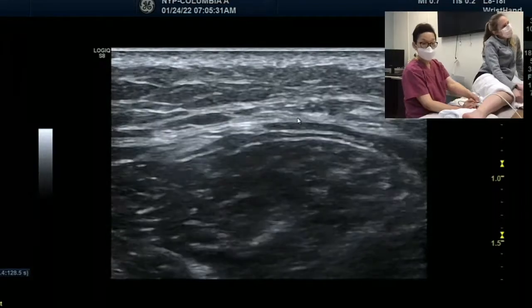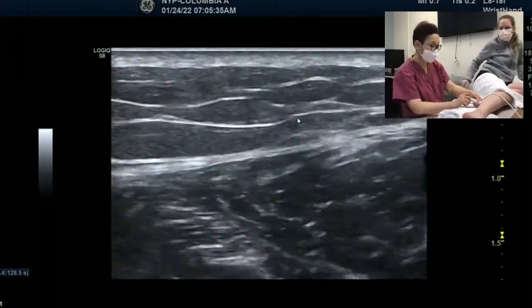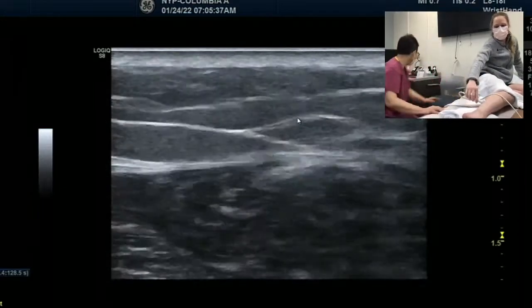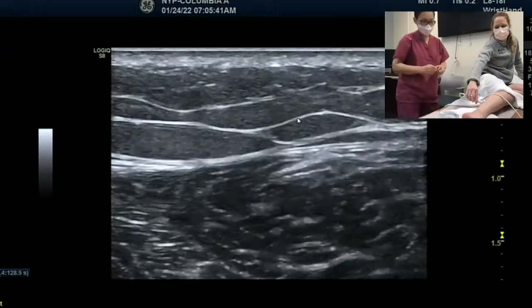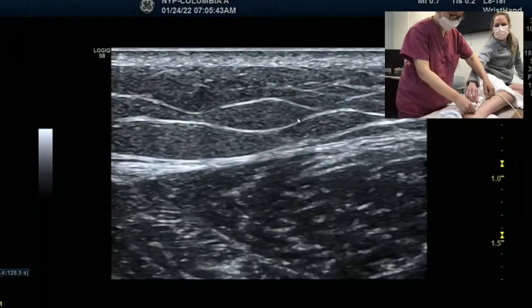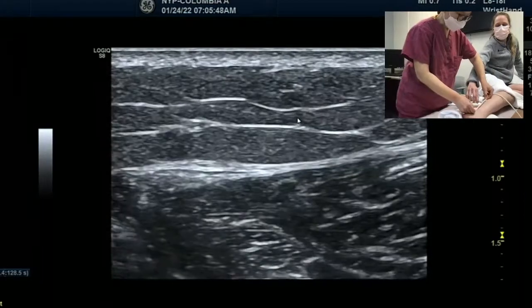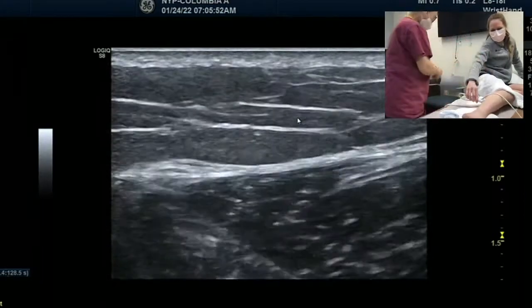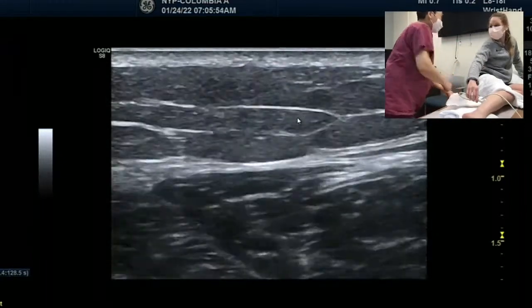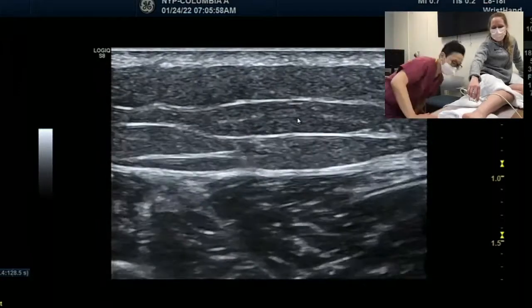So I wanna show you guys where my probe is. Maybe you wanna hold it, so I can measure from your ankle. Are you kidding me? Is it exactly? Really? 14 centimeters? Nice. This is amazing. That's where you would put your electrode. You pick up the sural nerve when you do a nerve conduction study.